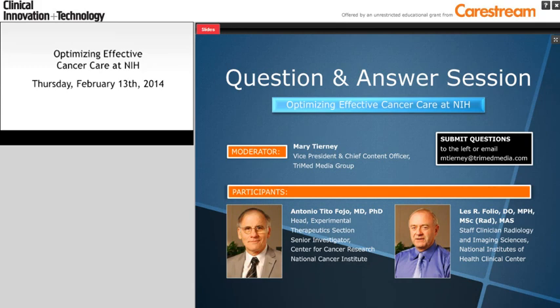Since much of it is either semi-automated, such as the first baseline exam, for example, where one will click on a lung lesion, then it'll automatically segment, then that will then automatically export to the lung lesion area. One clicks on the lung tool that designates it as a lung lesion, for example, and then say there's a liver lesion. One has to stretch the calipers across the lesion. It's automatically segmented, or semi-automatic, since one has to click on it and stretch the calipers as the traditional caliper measurement. Then when that is segmented, it's automatically exported to the liver tab and so on.